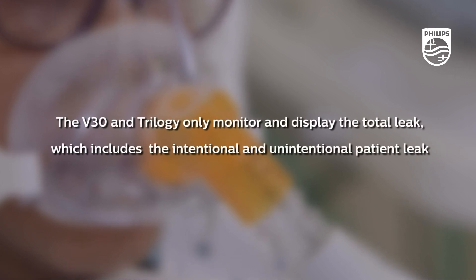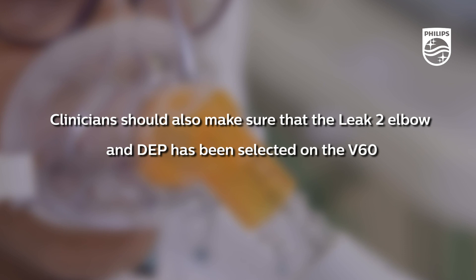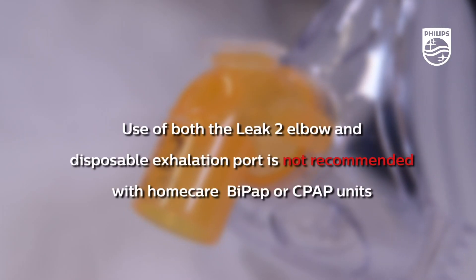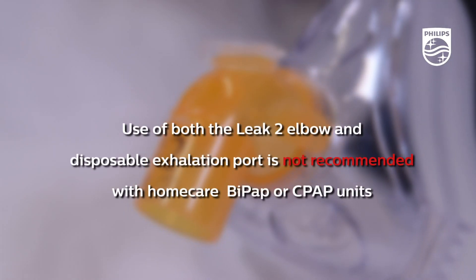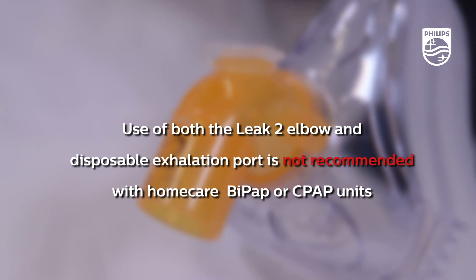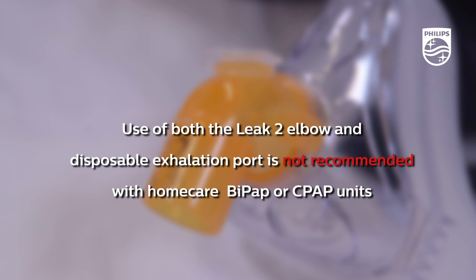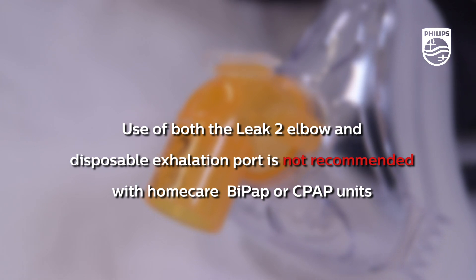The V30 and Trilogy only monitor and display the total leak, which includes the intentional and unintentional patient leak. Clinicians should also make sure that the Leak 2 elbow and DEP has been selected on the V60. Use of both the Leak 2 elbow and Disposable Exhalation Port is not recommended with home care BiPAP or CPAP units due to limitations to total leak compensation with these types of devices.